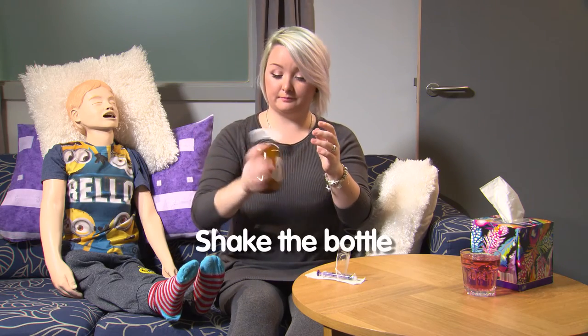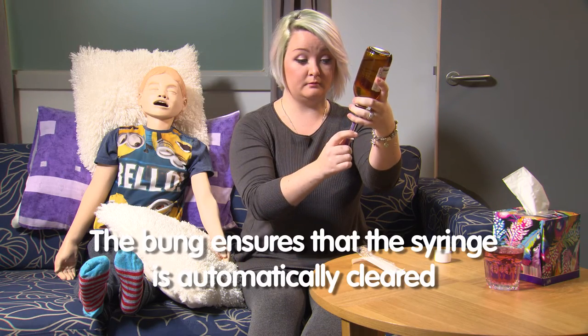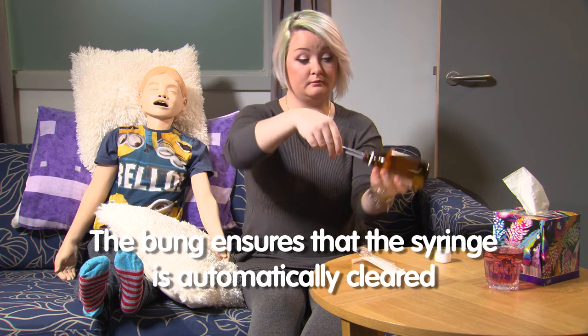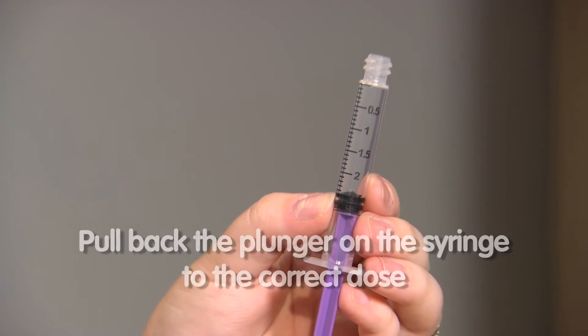Firstly, you need to shake the bottle well and remove the cap. You need to ensure that the syringe is clear of any liquid before administration. This happens automatically when using a medicine bottle with a bung. Pull back the plunger on the syringe so that the top of the black ring is on the dose you need to give.